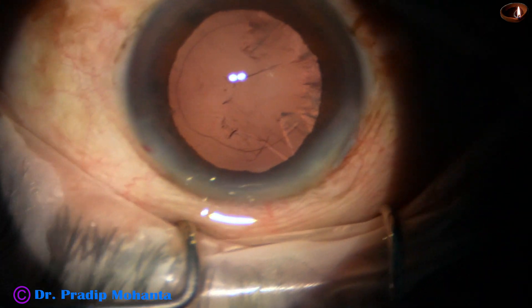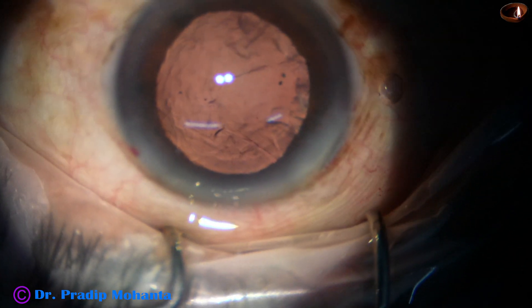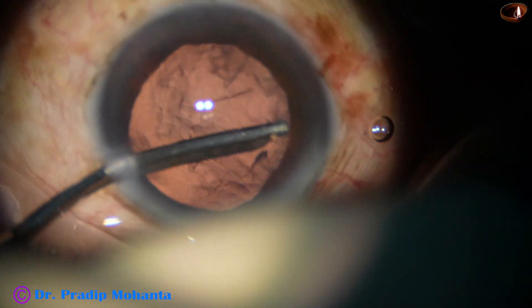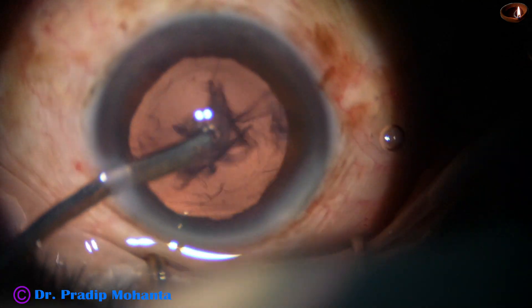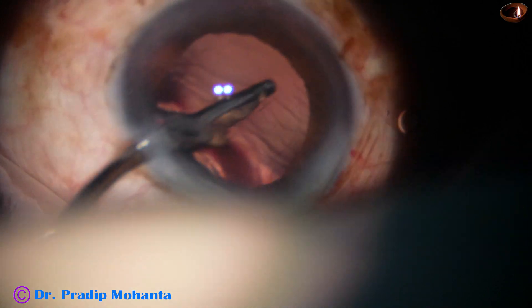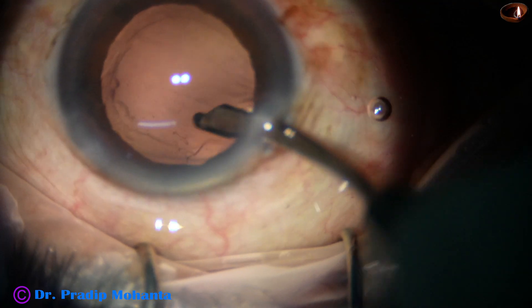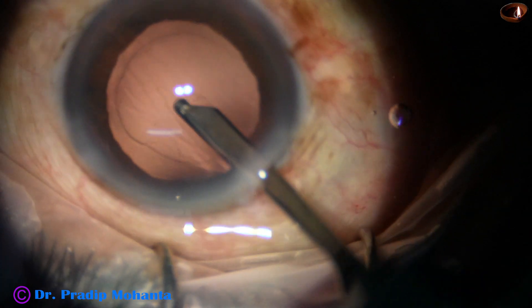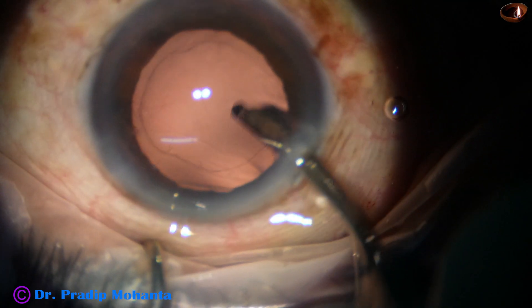Some visco is placed in the anterior chamber and the rest of the cortex is being removed using a 23 gauge Simcoe. The width of the side port is about 1.7 millimeters and the 23 gauge Simcoe easily goes through it. I have only one side port, 90 degrees away from the main wound. Whatever astigmatism is being produced by the main wound is neutralized to some extent by the side port.